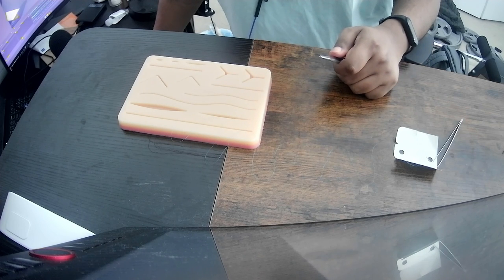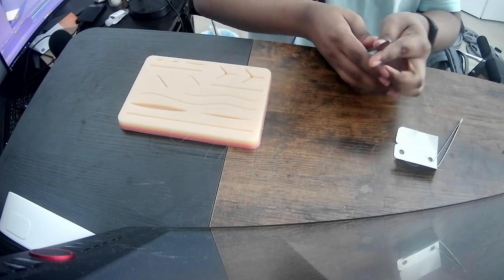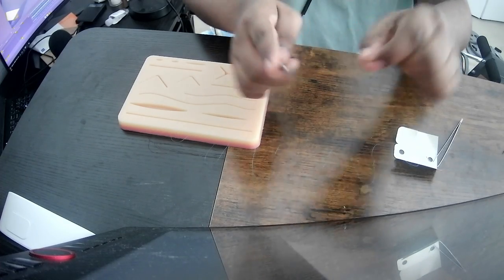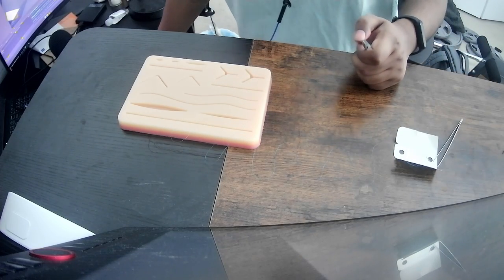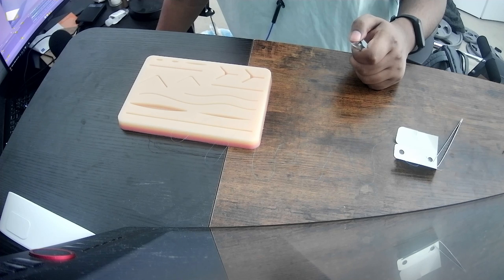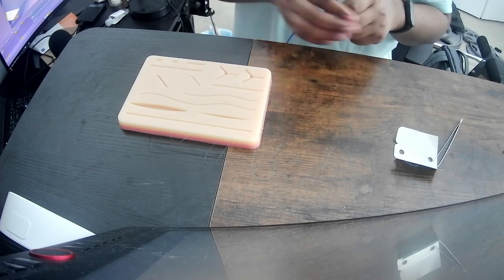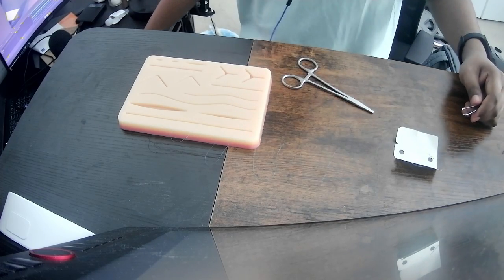I already practiced bigger bites, and practiced unloading and manipulating the needle once it's already loaded. So I'm pretty comfortable with the tools for now, the basics. Loading it closer, or you can do it in whatever way you want. Now we can start practicing loading the needle. The next step, just like in real life, once you've loaded your needle, is that you're going to start throwing some sutures. Okay, we are going to throw some sutures tonight.